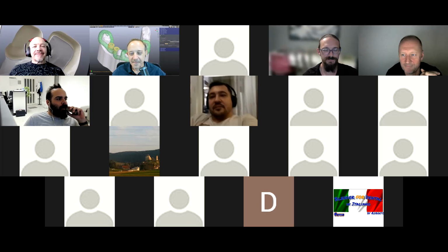Wow. Quite a lot of work at the office for the moment, but thank you for this presentation. I really like the way you handle the bridge. I think we should also have a lot more teeth libraries in the shop. I think we lack some.